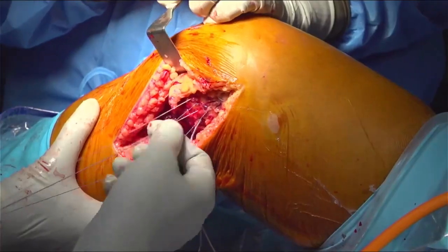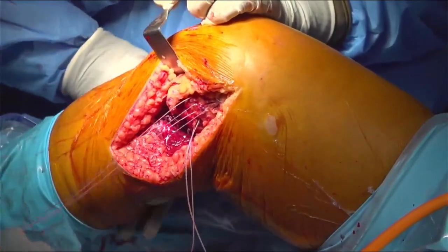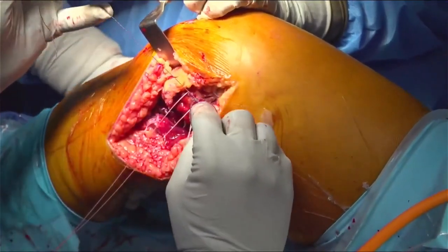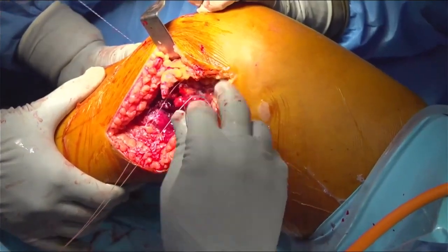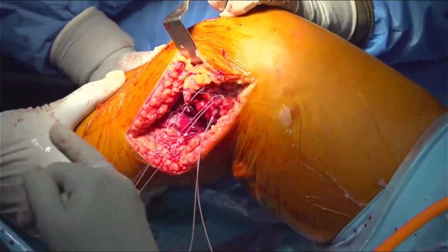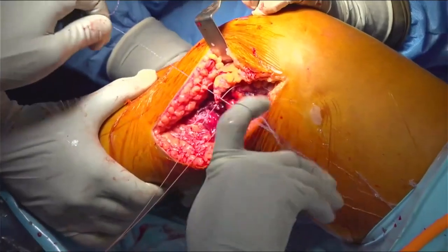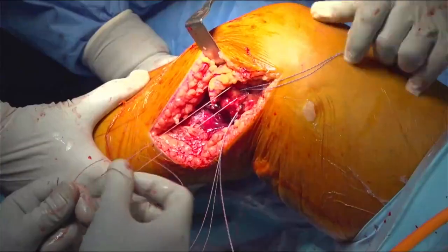LR anchor please. So anterior drawer please. Full anterior drawer, and we are closing the anchors, the meniscotibial ligament first. So this is my first suture. This is my second one.